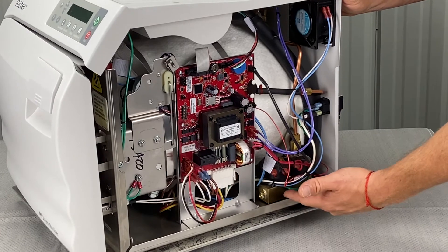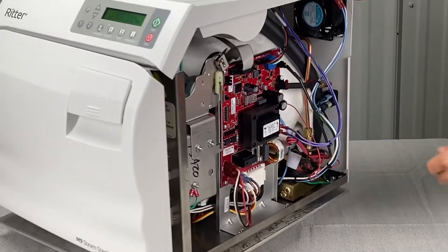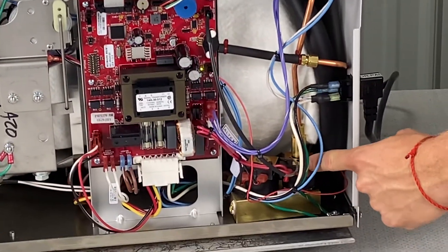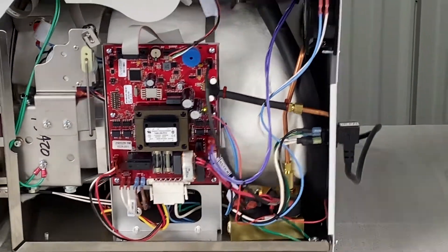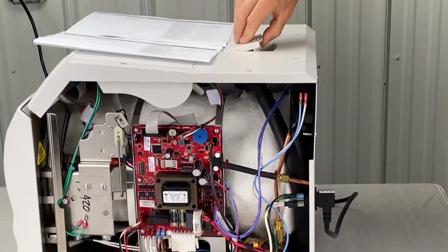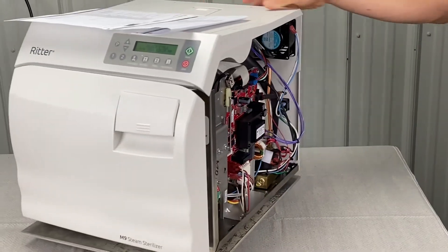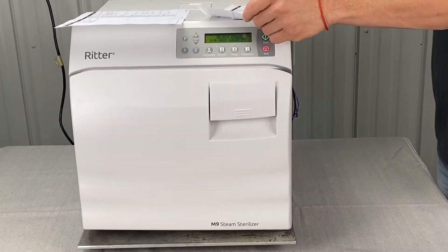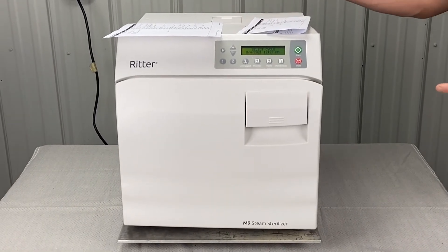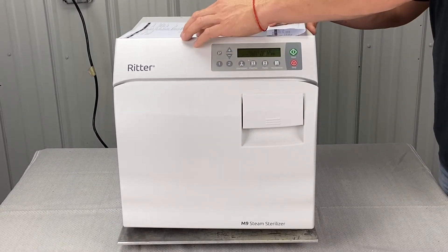It could be the manifold block leaking, either at the stem or the plunger. There's also an air fill vent valve and an air vent bellows in the back. There's also a pressure relief valve — if that gets stuck open, it will leak under the bottom right corner. If you can take the cover off and run a cycle that way, you can see these things failing in real time for a more accurate diagnosis, but at that point I'd just send it in to a technician.